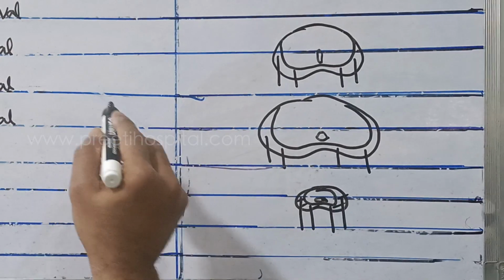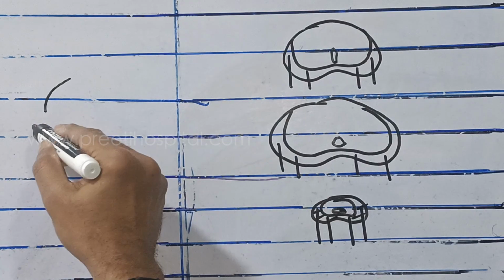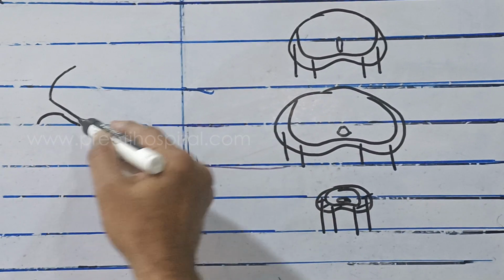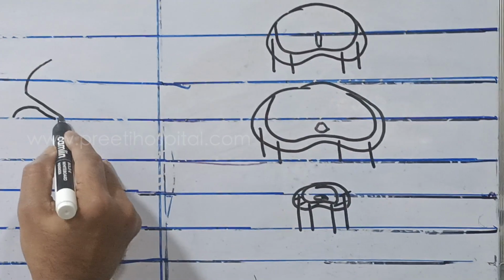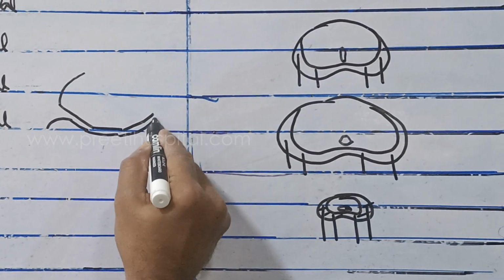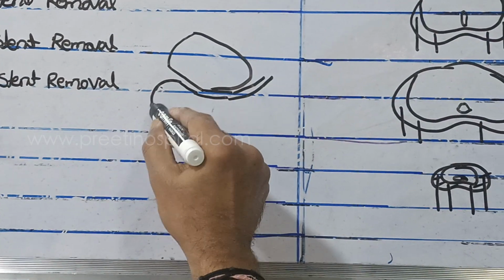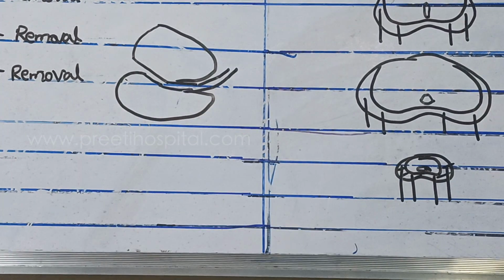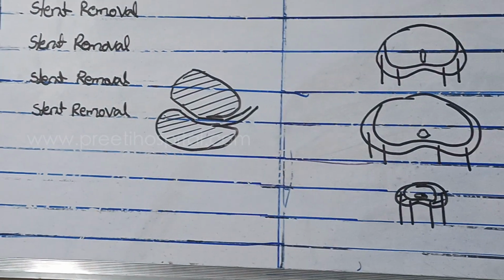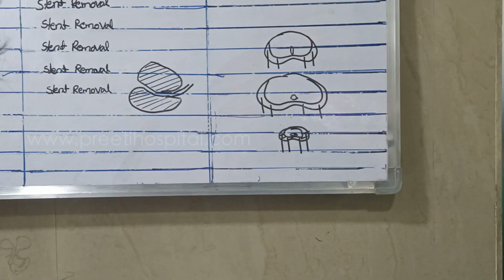The prostate will be normally, the base will be here, the urethra will open here, like this. This is what you see when you go up with the cystoscope, and it will come like this, and it will go like this to the membranous urethra. And this is the prostate, and this is the prostate. Only thing is that what you are seeing is on one side, what is behind is on the other side. You got the point? Correct?